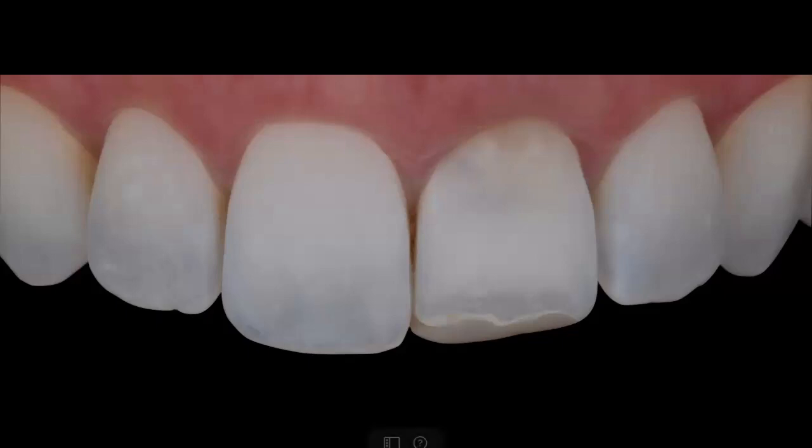And the things that I want you to see is, number one, you can see that halo, that darkness that the actual tooth had on the cervical third. And that darkness has to do with a very thin enamel because there was a lot of resorption in that area. And what you're seeing underneath is the translucency of the different biomaterials that were used to restore that area of the tooth: the MTA, the composite on the lingual, the J-Restore on the cervical.